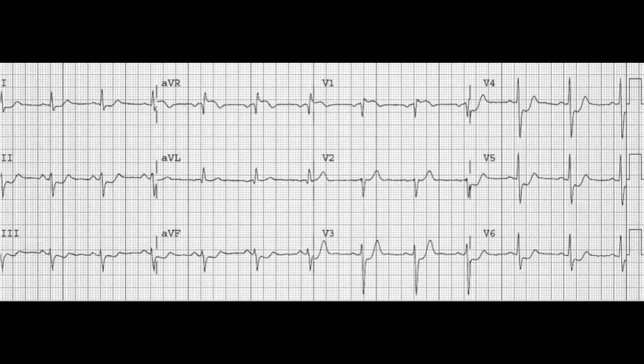If you look at lead 1, 2, 3, AVF, V3, V4, V5, and V6, we see ST depression. So elevation in AVR with fairly consistent ST depression across our inferior and precordial leads could be indicative of a left main coronary artery occlusion.